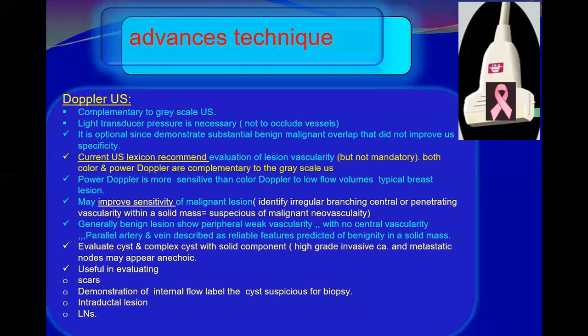What else? Also inside the ducts, the same concept: we have intraductal lesions. Excellent, well done. Helpful in intraductal lesions. What else? Helpful in the axillary lymph nodes. Excellent, well done. Okay, what else? Mastitis and inflammatory processes in the breast.